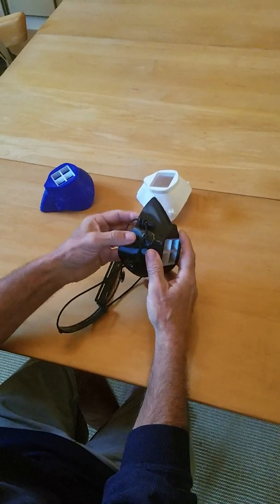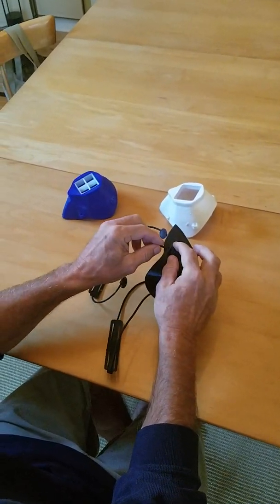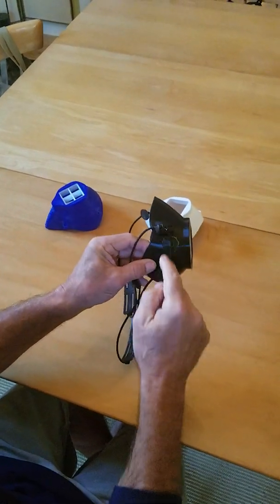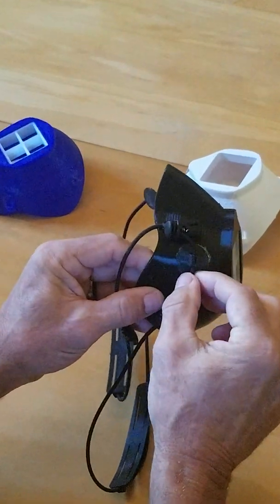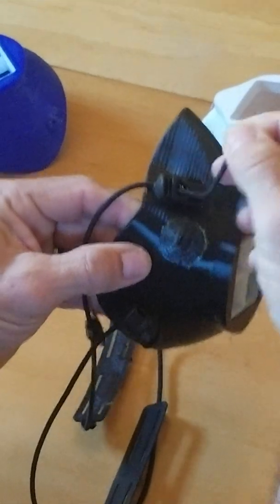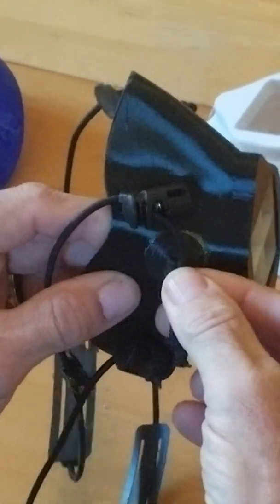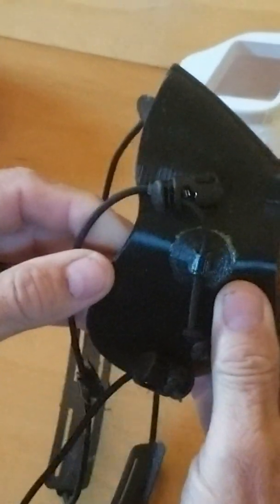And then this is your adjustable length, so you can adjust this while it's on you. You have one on top, one on the bottom. This one tends to be longer, and the end might get in your way. And so there is this little cup right here attached to the mask where you can clip in the extra string to stay out of your way.